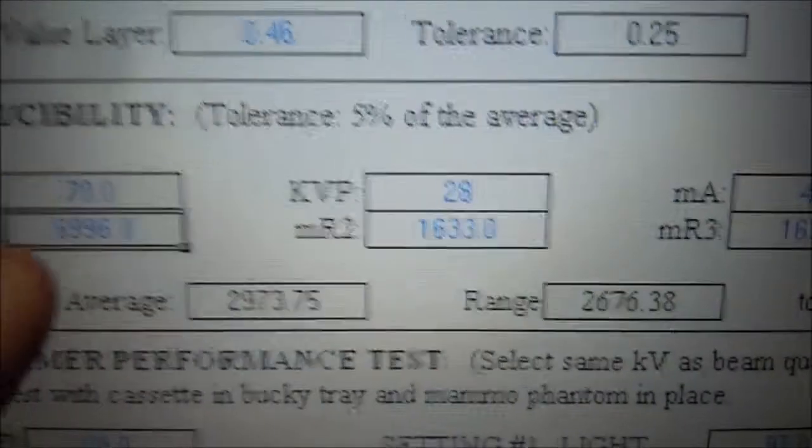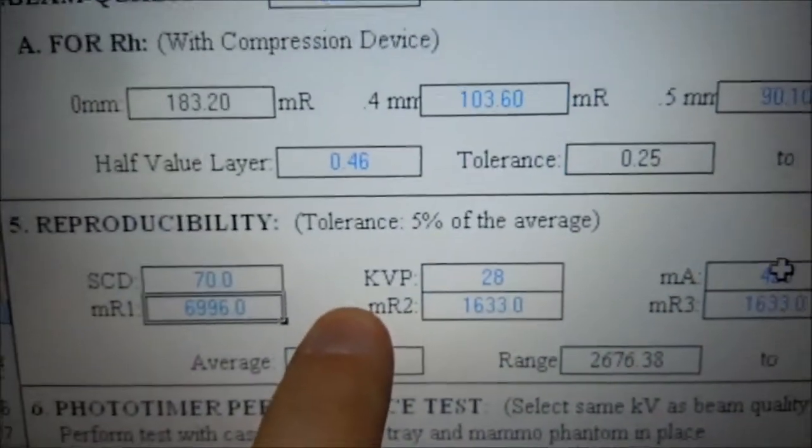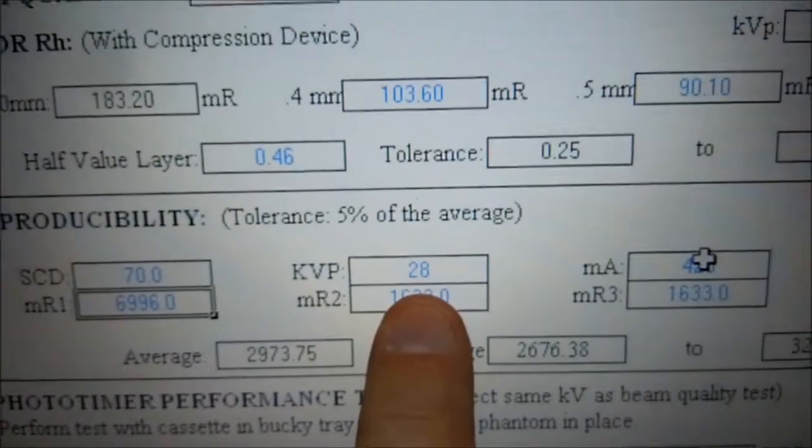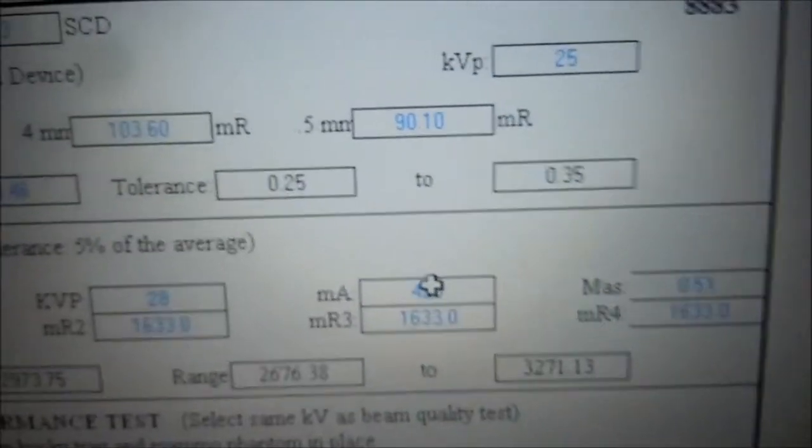We're going to take a series of eight shots. We're going to take the first shot, pause, take another shot, then take another shot and document, take another shot, take another shot and document, then take another shot.